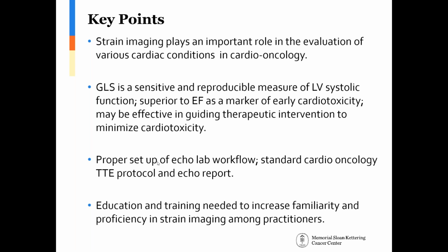To work around that, I insisted that our administration put the strain software on all of our reading stations. It is impractical to expect readers in a busy lab to go online and review the strain tracing. As a result, all the readers can confirm the strain tracing at their workstation, which obviously facilitates that process significantly.